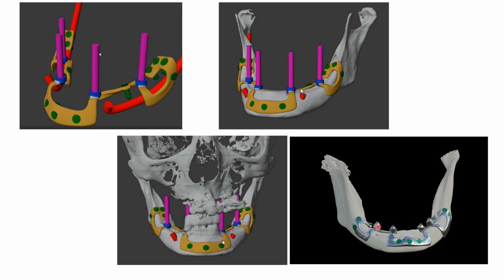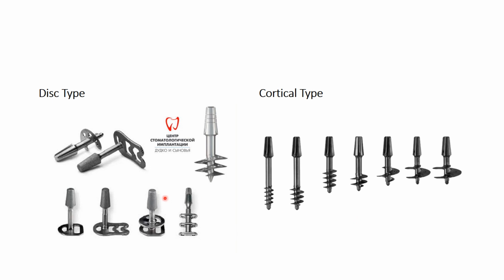It may be a hybrid process, it may be a bridge, a metal ceramic bridge that may be fabricated. Okay, so this is some other type of implants. Just like the blade implants, we also have some implants known as disc type of implant.